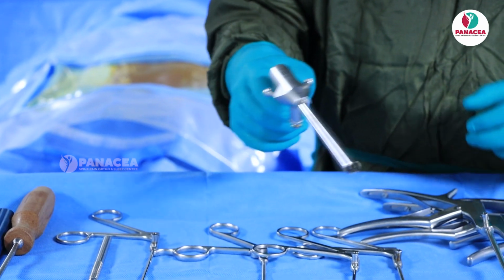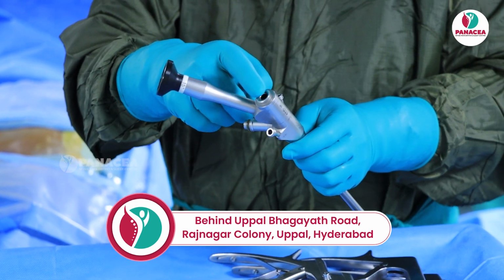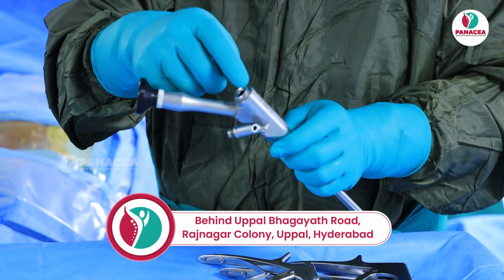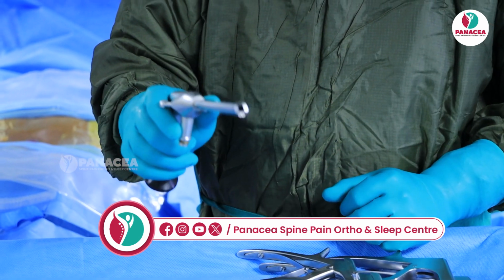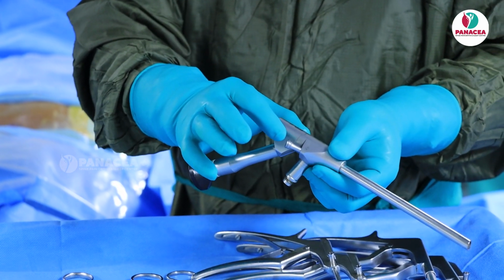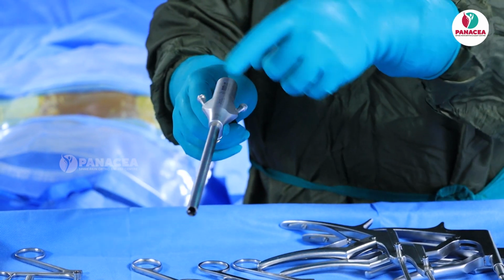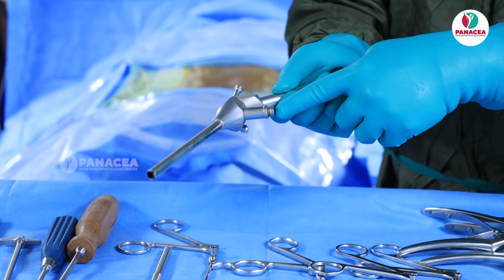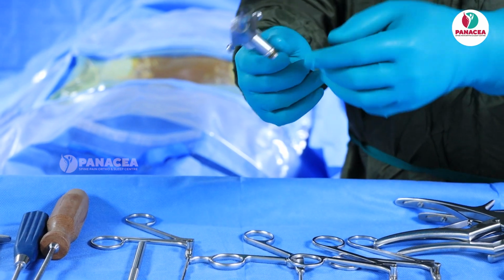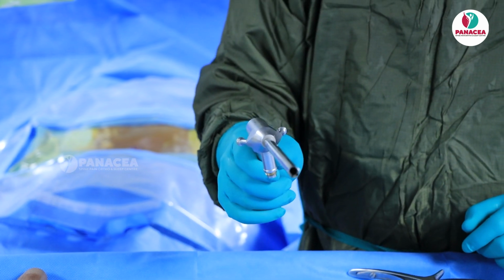So you are seeing this is an endoscope. It has a working channel. This is called a working channel endoscope. It has an internal diameter of 5.7 and an outer diameter of 8.2. It has two irrigation ports, one for ingress and one for egress of the saline. And you can see here, this is for the illumination part, the light source. And the optical system which we use here is the rod lens system.